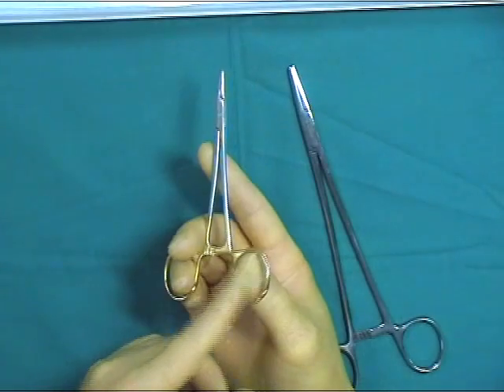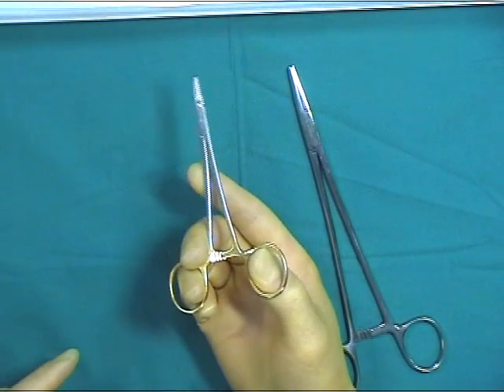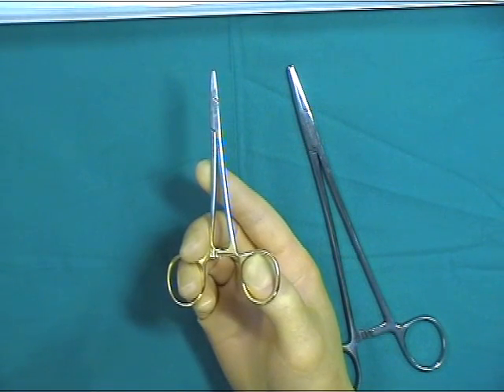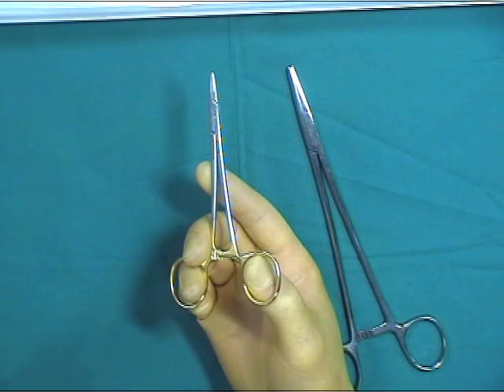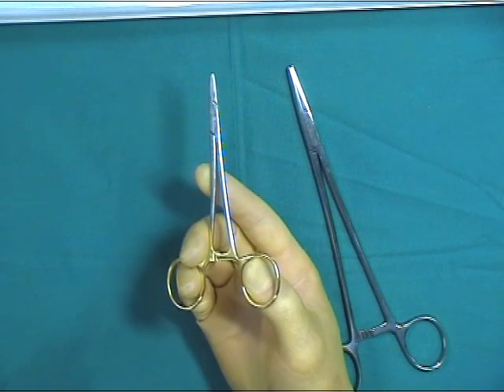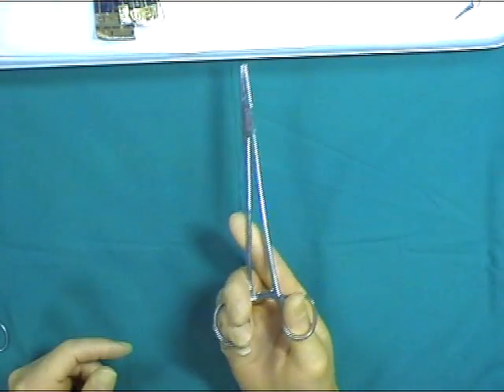The needle holder is held in a similar tripod fashion, using the thumb, index and ring finger. The ratchet mechanism generally requires just one click to securely hold the needle, without causing damage or bending to the needle with too much force.